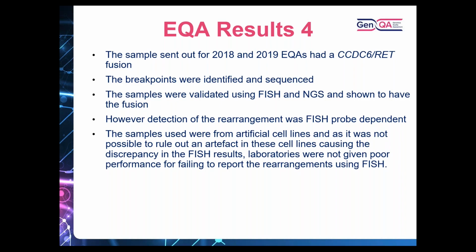So in particular, for the 2018 and 2019 EQAs, we sent out a sample which had a CCDC6-RET fusion. The breakpoints of this fusion had been identified and were sequenced, and we had the samples validated using FISH and NGS, and the rearrangement was shown to be there using the FISH that our validating laboratories used, and the NGS confirmed the presence of the fusion.